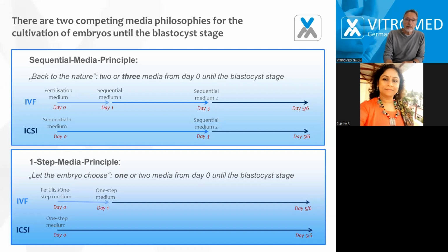With ICSI, you can put them directly in the first sequential medium, but you also have to change the medium at day 3.